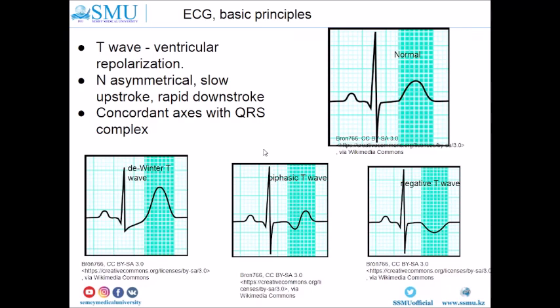The next point to analyze during ECG interpretation is the T-wave. We should pay attention to the symmetry, shape, and morphology of the T-wave. The T-wave represents ventricular repolarization. Normally, the T-wave is asymmetrical — meaning it has a slow upstroke and rapid downstroke. Usually, the axis of the T-wave is concordant with the QRS complex: if you have a predominantly positive QRS, you will find positive T-waves.